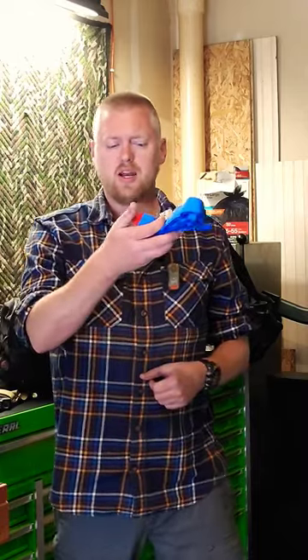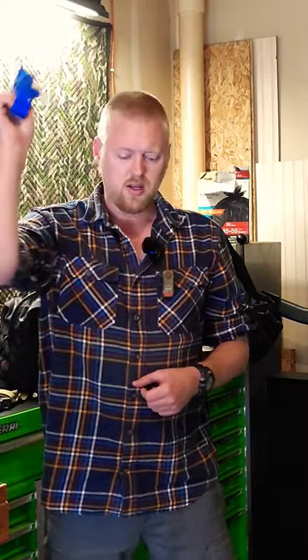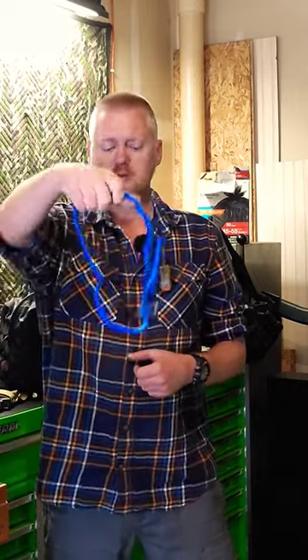When you go to grab it, you got this little red tab located — you grab onto the first layer of the tourniquet only. Whip it out with one hand. It's open, it's ready to slip over whatever leaking appendage you have.